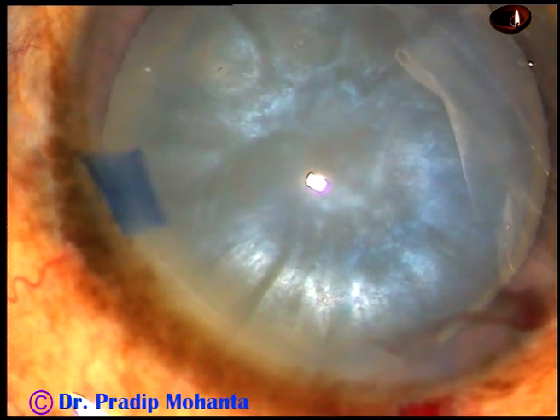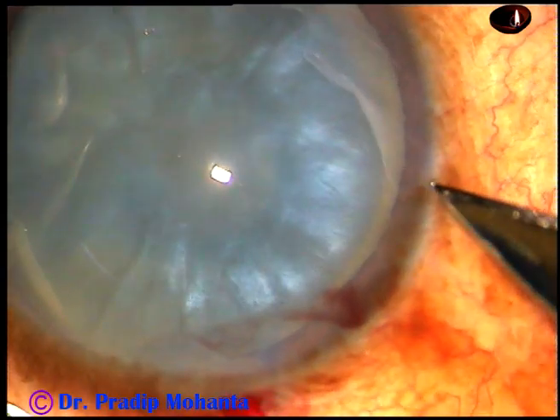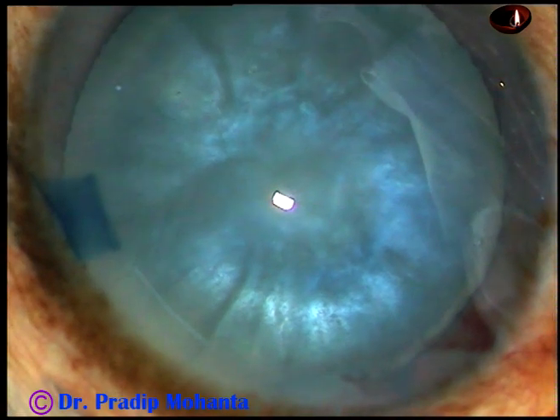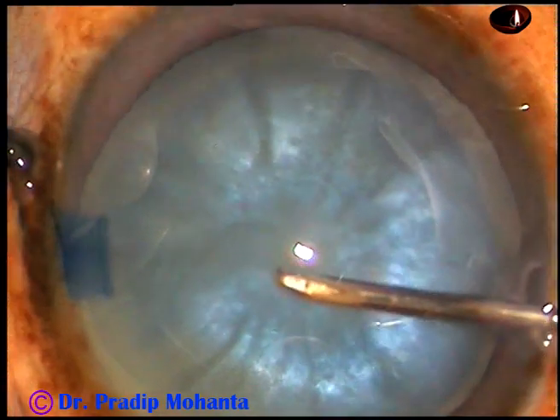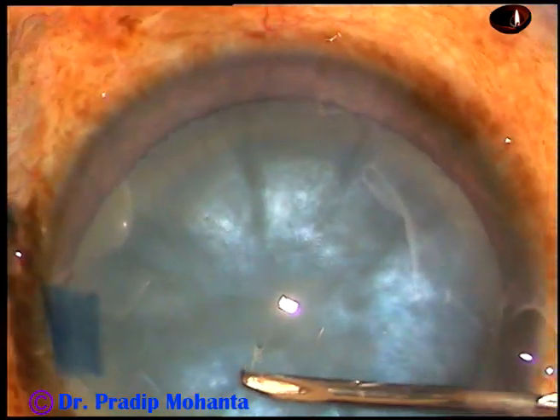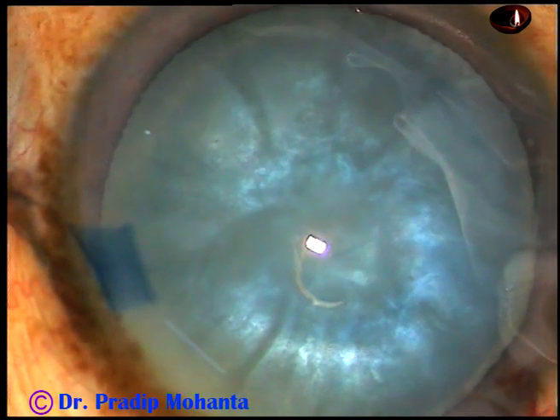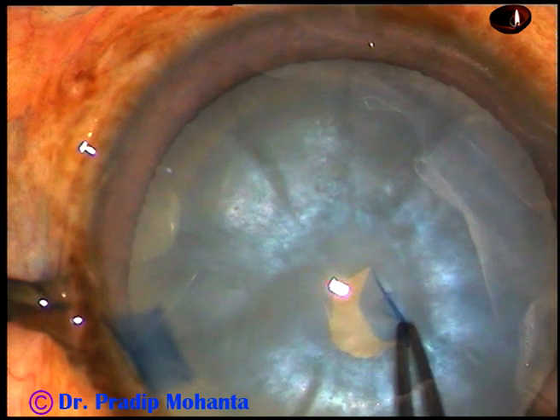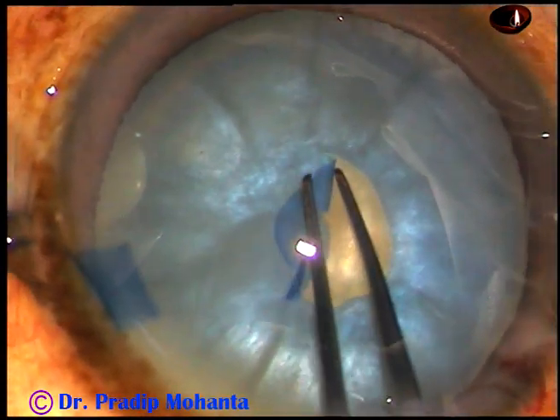And now, one more paracentesis is being made on the right side of the main incision, about 2 o'clock hours away. And now, a 26-gauge bent needle is introduced. A C-flap — a curved flap is made. And then this C-flap is converted into a mini-rhexis.